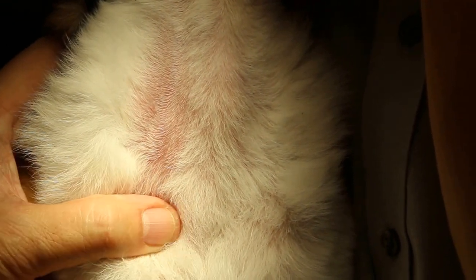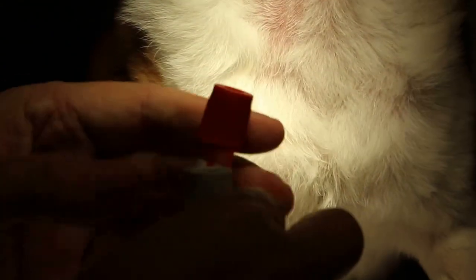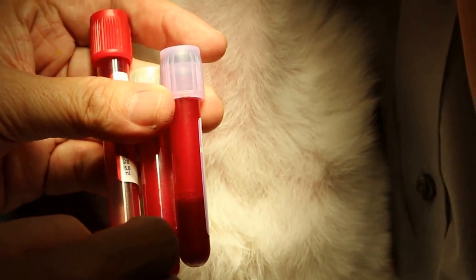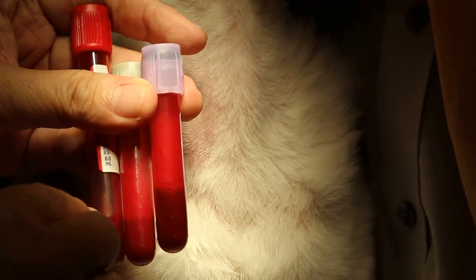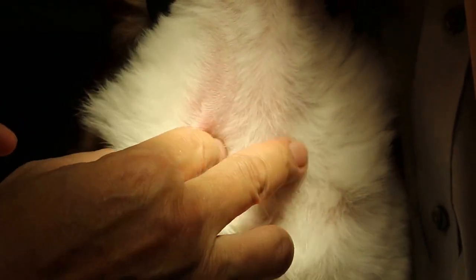And then you just draw the blood out. As you can see from the tube here, you can get 3ml quite easily. You can get quite a lot of blood. This one was taken from two sides — one side and this side. But actually one side will do; you don't really need so much blood. You can see two areas were taken from here, and one area was taken from here.